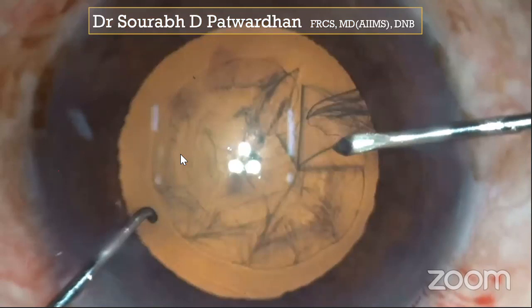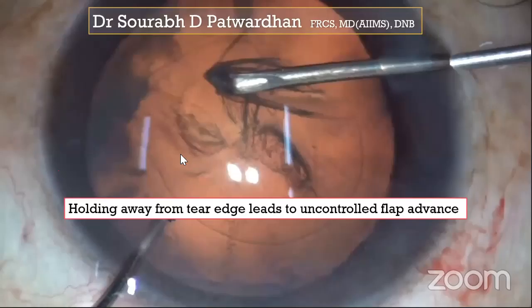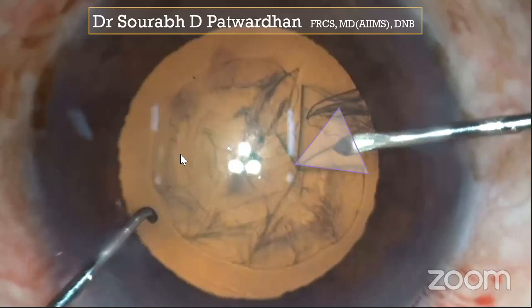The same rule of center of triangle should be observed even when you are doing the subincisional CCC. The same triangle applies. Here the common mistake surgeons make is they try to hold the flap near the peripheral edge, because they feel that way they have better control over the capsulorhexis margin. But that maneuver is a little difficult because then you are trying to tilt your cystitome. And also you are not in proper control, because then the cornea starts getting dry. So it is better to hold it at the center of the triangle and then proceed.